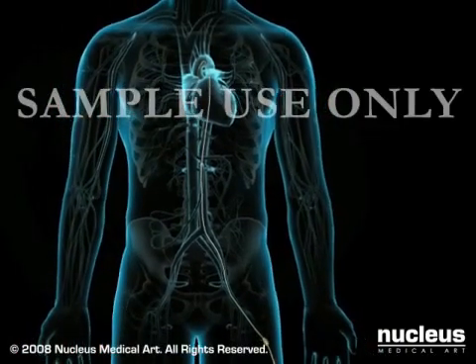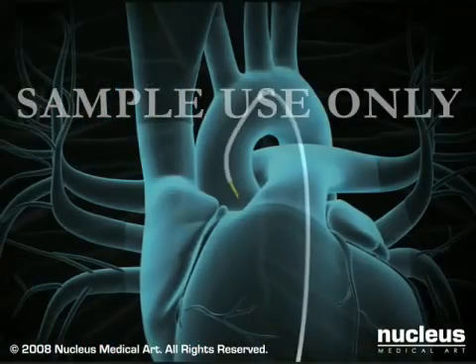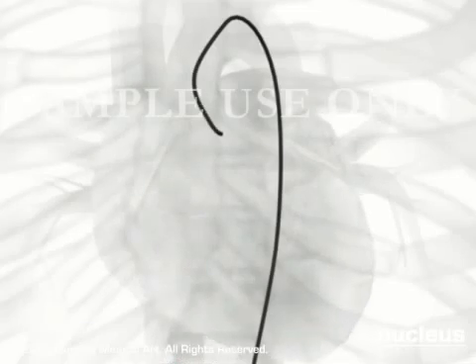You may feel pressure as the wire and sheath are inserted, but you will not feel their movement inside your arteries. To evaluate the coronary arteries, your doctor will remove the guide wire, position the tip of the catheter just inside the arteries, one at a time, and inject a special dye.